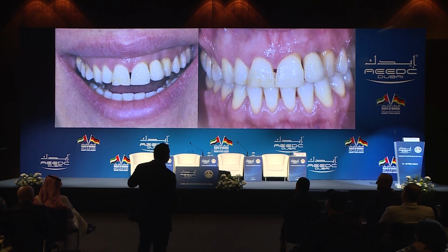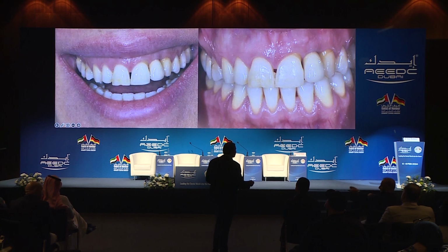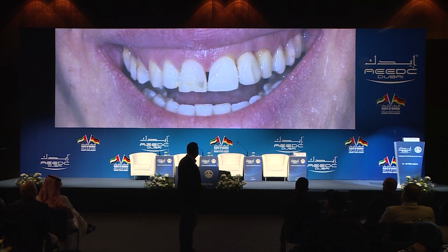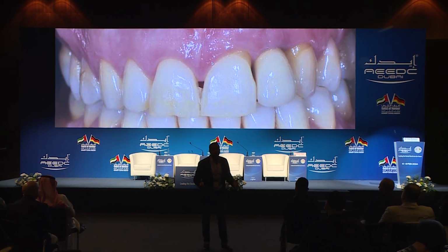And I didn't really want to treat her because this is a high smile line, gummy smile implant. If you look at this, there's an attachment loss on both sides of the implant. This is not gonna work. I felt this is a case where you cannot really achieve a good result with the treatment. And what I proposed to this patient, I said, listen, the best thing to do is probably crown lengthening and veneers on all your teeth.